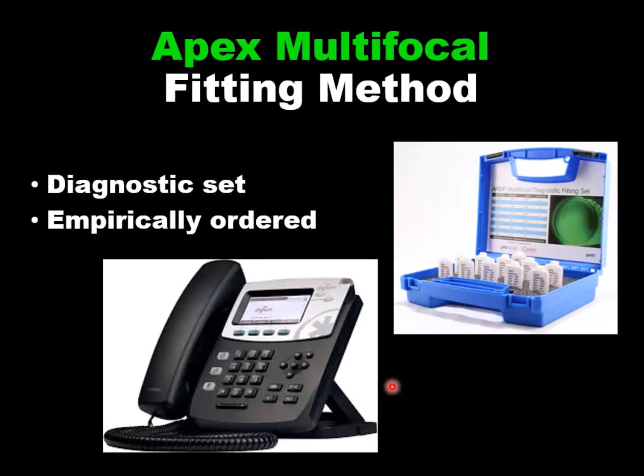To fit the Apex Multifocal, you have two methods. One, you can use the diagnostic set, trial fit the patient, determine the best base curve and overrefraction, then order based on those parameters. The other option is to empirically fit from Ks and Rx or topography and Rx.